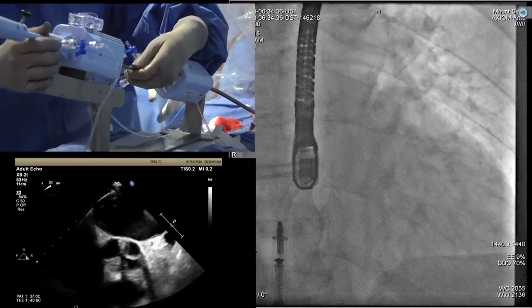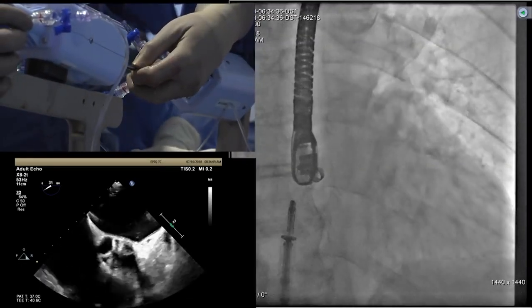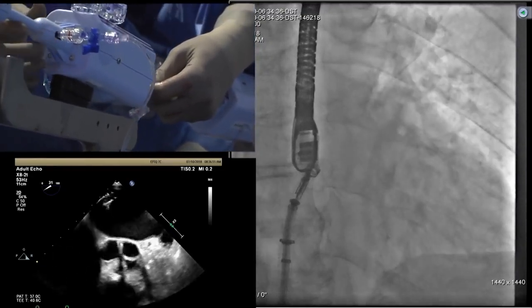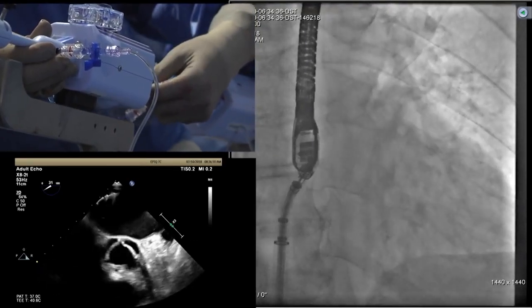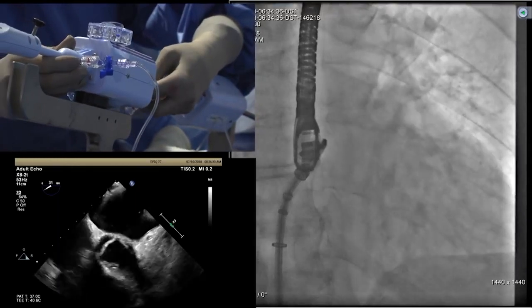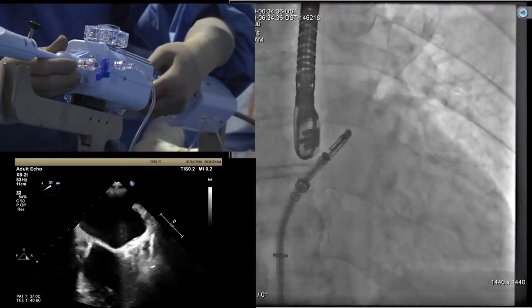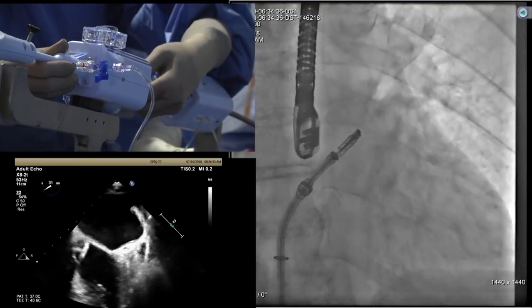Now the next important part is the straddle as it comes out. So now you see the clip is coming out. I'm advancing with the left hand, and with the right hand I'm going in. You see that? So everything is going in. Nice. This is a very good demonstration of a well-controlled advancement. One can stop the device at any time. Now I have straddled it, and I'll explain what straddling is.